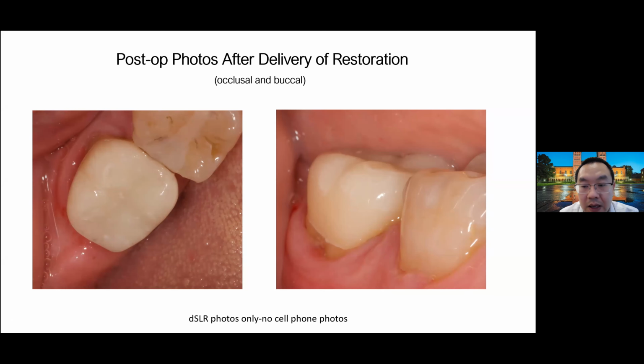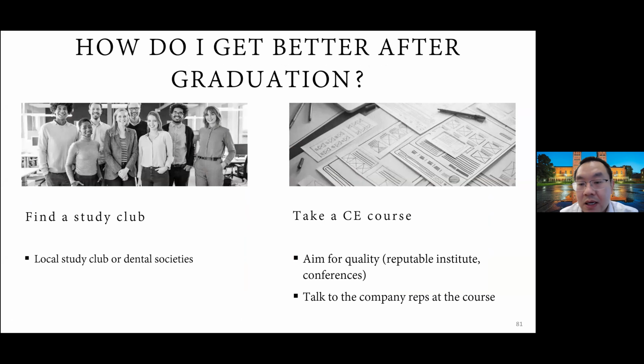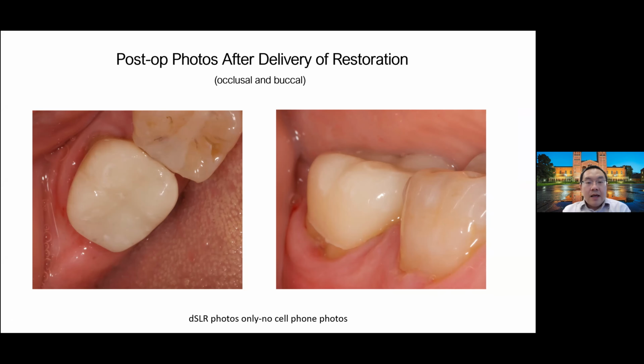Okay, can we do better? Yes, we can probably stain the tooth a little bit yellower in the gingival third. Can you do chair-side staining in the IDDS clinic? Yes, we do offer that as well. So if you try it in and realize the stain is a little bit off, you can do chair-side staining. That takes another 30 minutes or so to fire up the oven, stain it and glaze it too. Okay. Any questions about the IDDS clinic before we go to the next and final part?